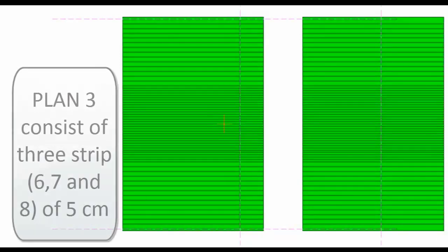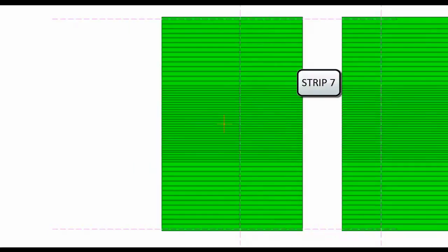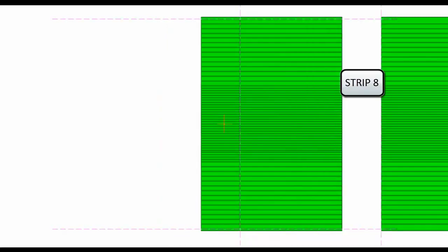Plan 3 is now exposed with the help of the MLC to expose strip 6, strip 7, and strip 8. Strip 6 is exposed first, then strip 7, and then strip 8.